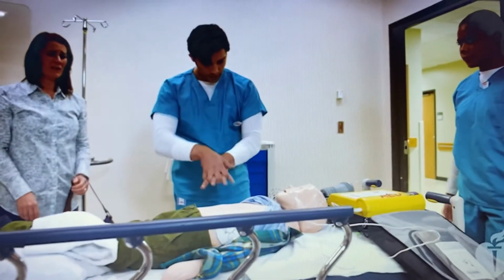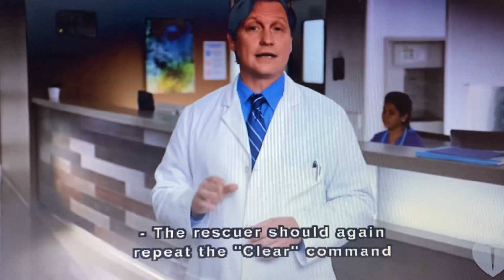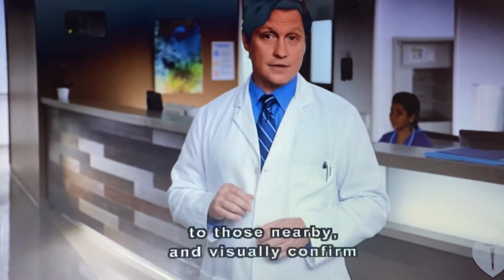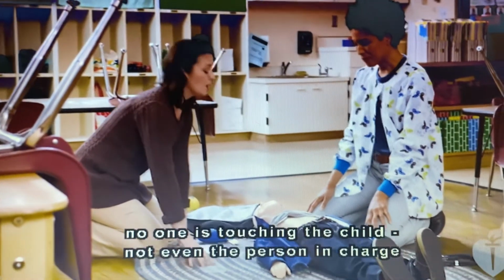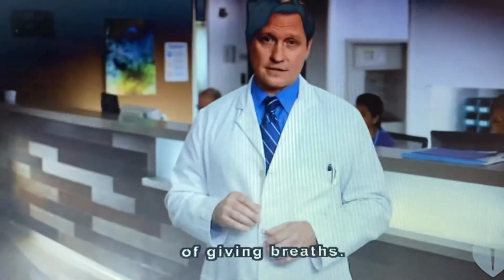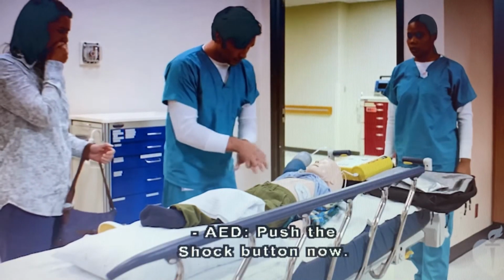Shock advised. Charging. Do not touch victim. Clear. The rescuer should again repeat the clear command to those nearby and visually confirm no one is touching the child, not even the person in charge of giving breaths. Then the shock can be delivered. Push the shock button now. Next, press the shock button.